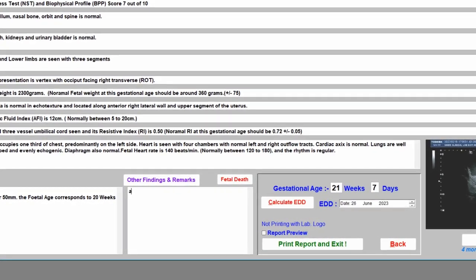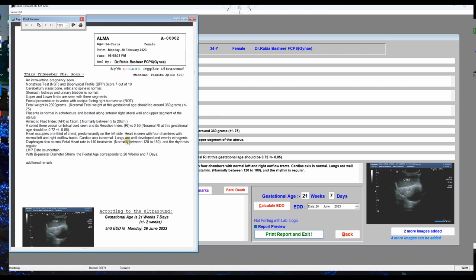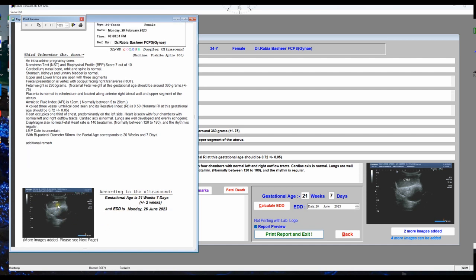If you want to add additional remarks, click the remarks area and write anything you want to include. To preview the report before printing, check the preview box, then click 'Print Report and Exit'. The report immediately displays everything you have edited, including the patient's name, third trimester obstetric findings, and additional remarks.